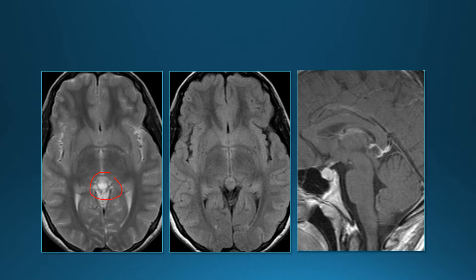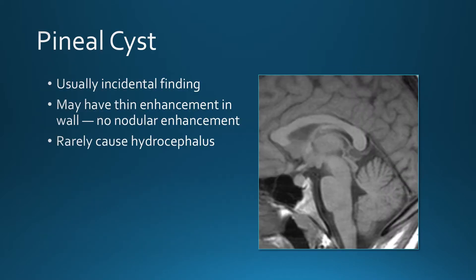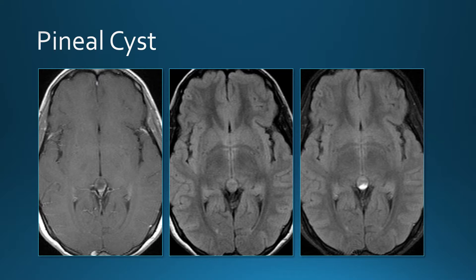Lesion in the pineal region — on post-contrast there's no solid enhancement, just vessels or maybe linear enhancement along the edge. We're talking about a pineal cyst. Usually these are incidental findings. They can have thin enhancement in the wall but no nodular enhancement. On post-contrast FLAIR you can see enhancement within the cyst because contrast leaks into the fluid — the pineal gland does not have a blood-brain barrier, so contrast can leak into the fluid.